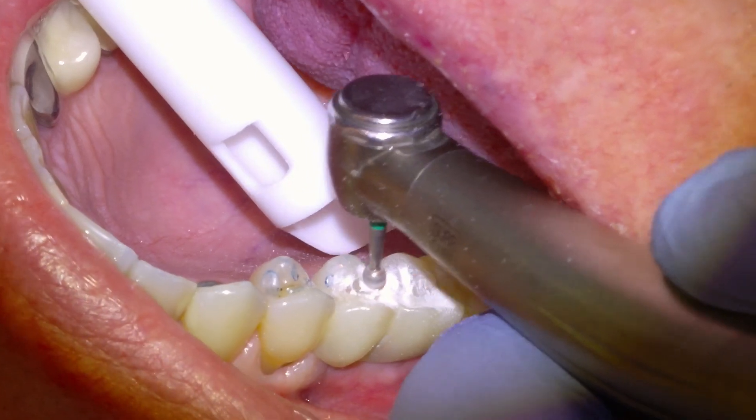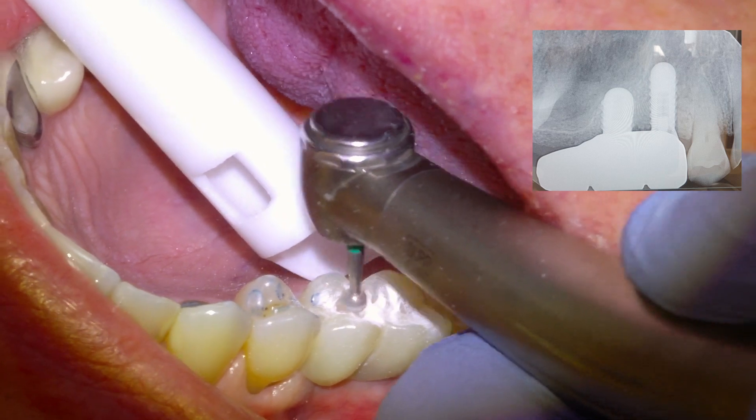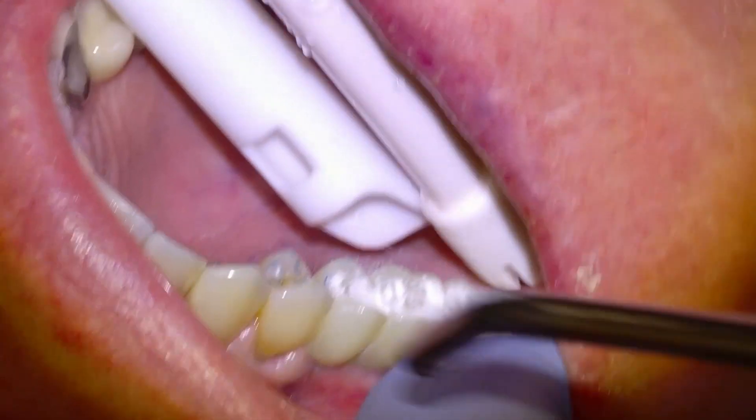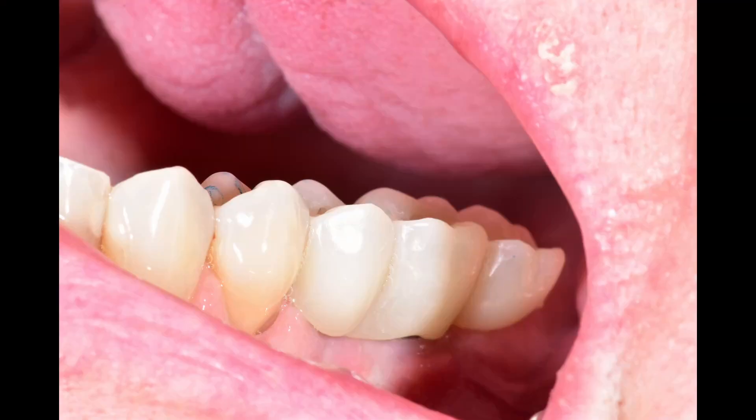And then that's pretty much it. There's an x-ray showing the bridge installed over the two implants, and I would anticipate nothing but long-term success in a case like this. Here's a photo showing the bridge in place — I hope that was enjoyable. If anybody has any questions or requests, feel free to leave them in the comments. Thank you.